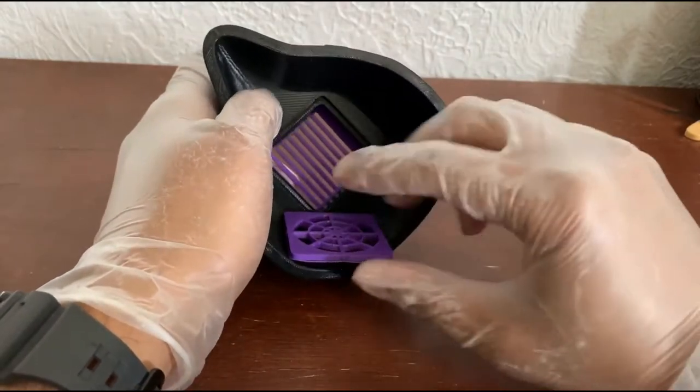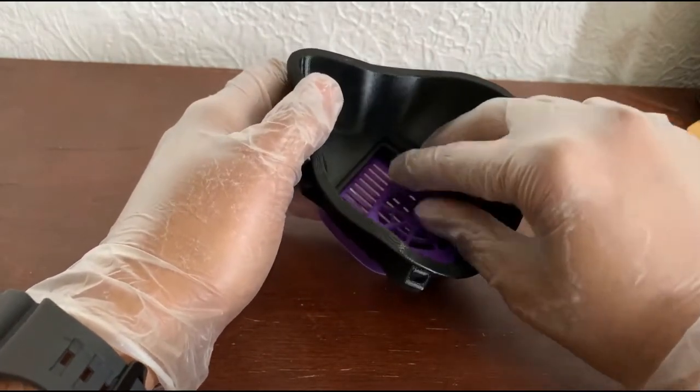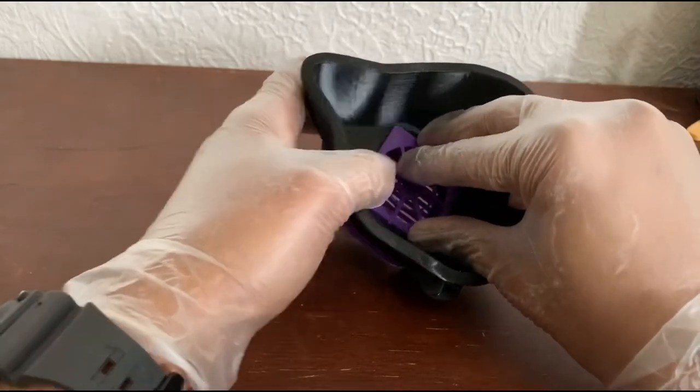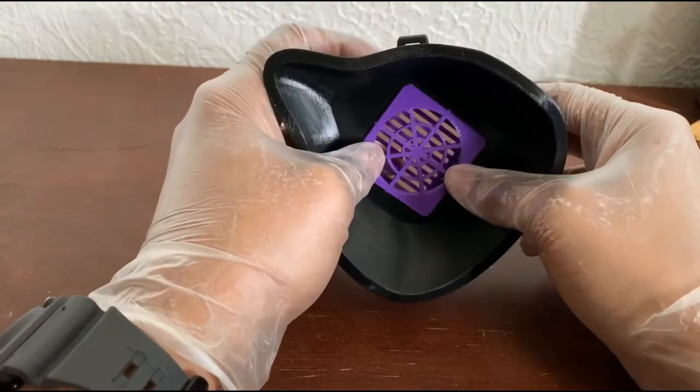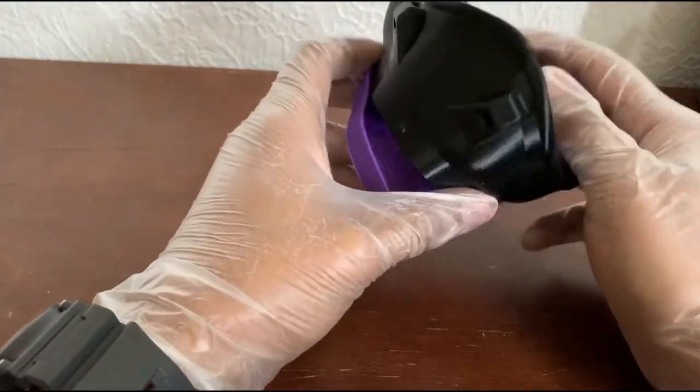USC has really good step-by-step instructions on how to make these masks, and we have a 3D printer working on this design.